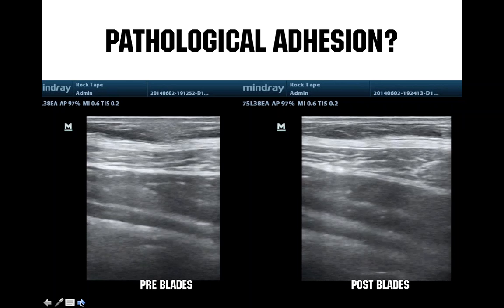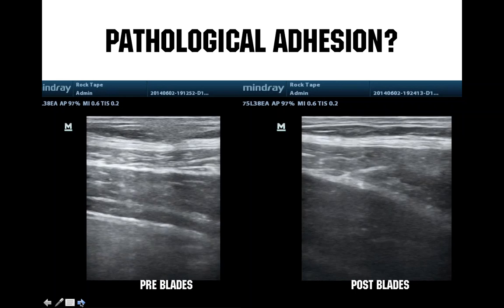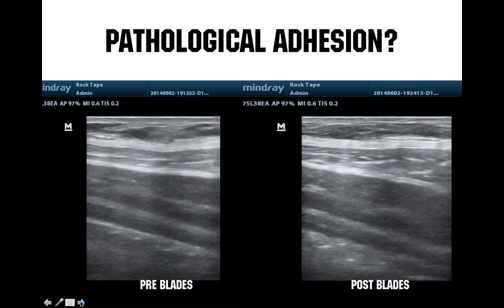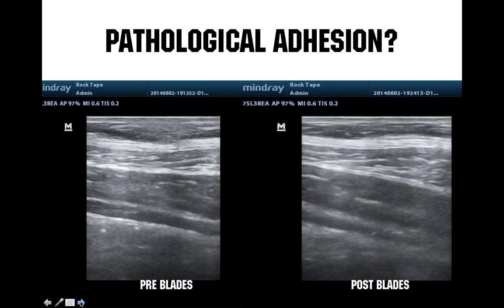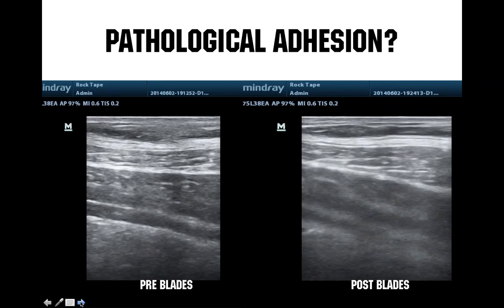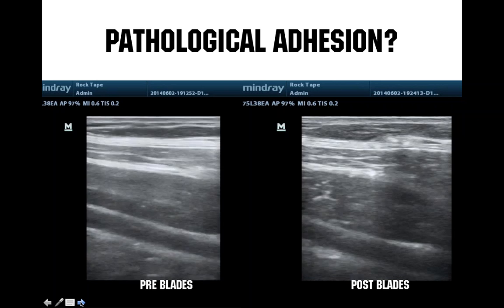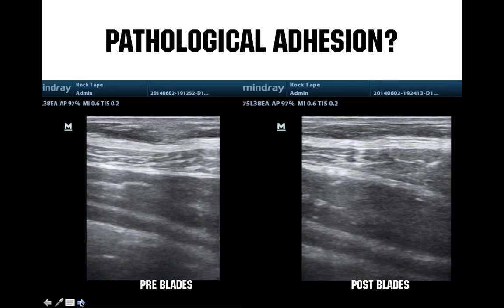And after we tool that post-blades, running the ultrasound head over the same area, you see that that tissue may be lessened and not influencing the fascial system as much or the fascial tissue as much. So these are some ideas that we use in class to actually change tissue and actually create some mechanical changes within the system.